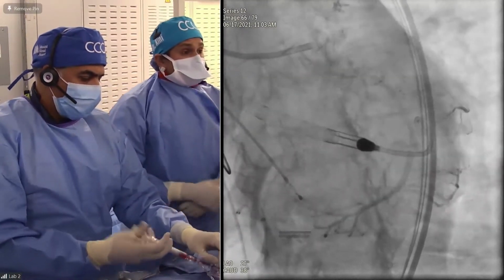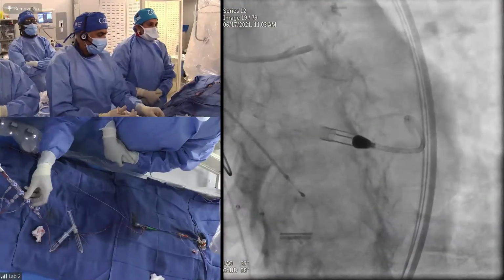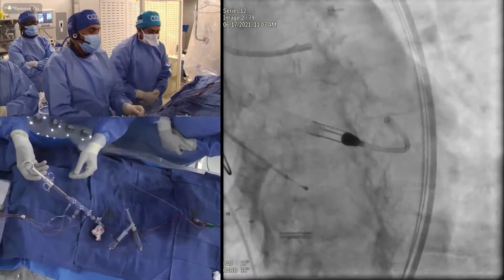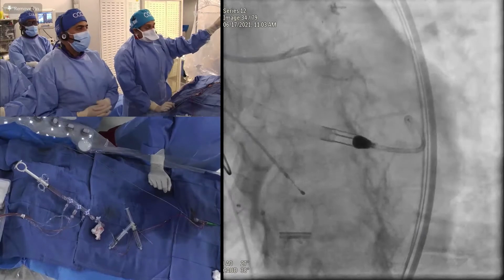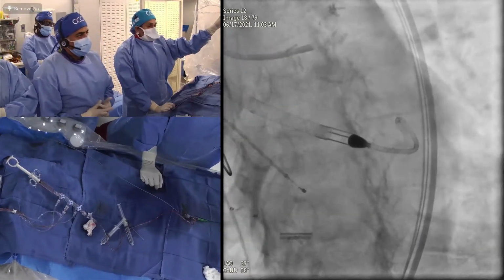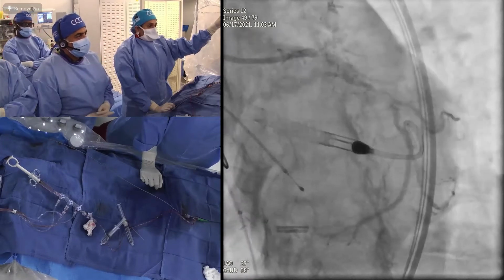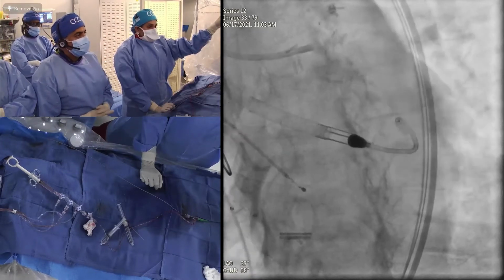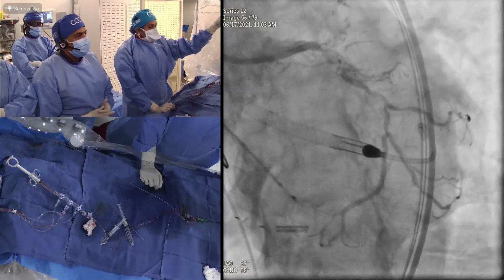So our plan is I have a fine cross, and I'm going to start with the Fielder. This is what we have actually mentioned also in the app, that you will start a case like this with a Fielder. I mean, it all depends. Everybody has to probably use a polymer jacketed wire to see if we can go through this angulated calcific vessel.